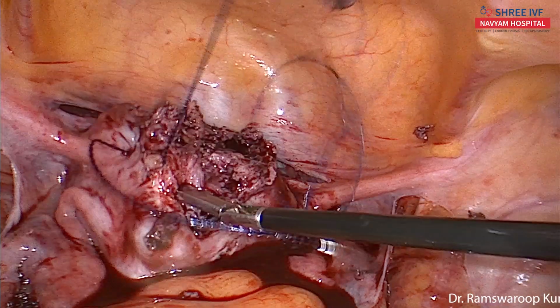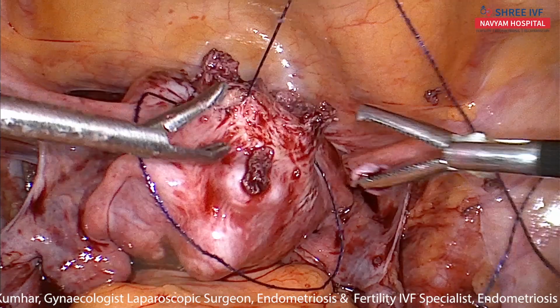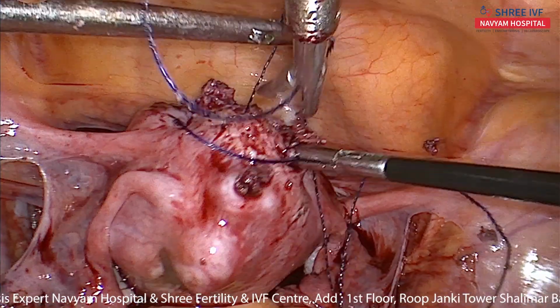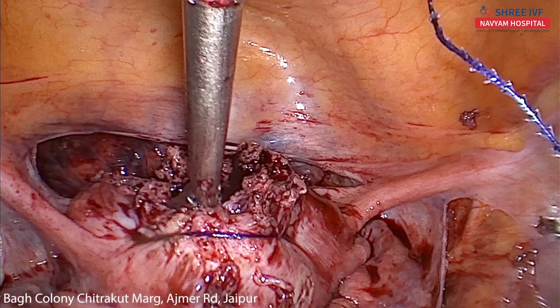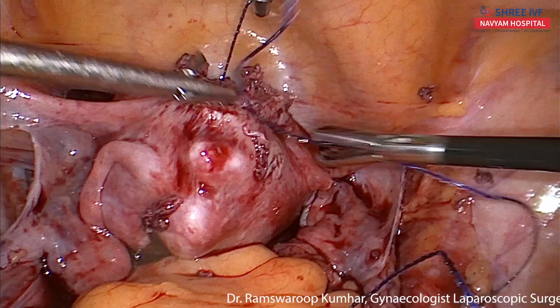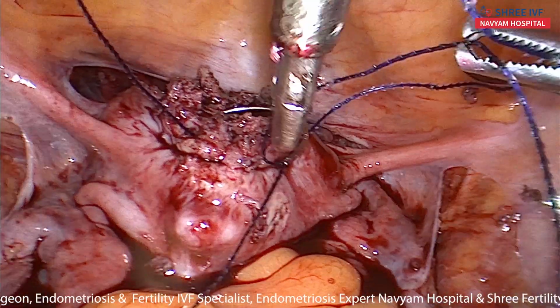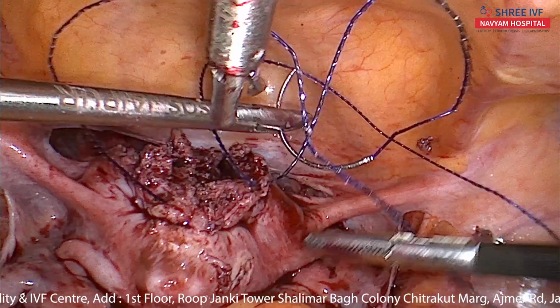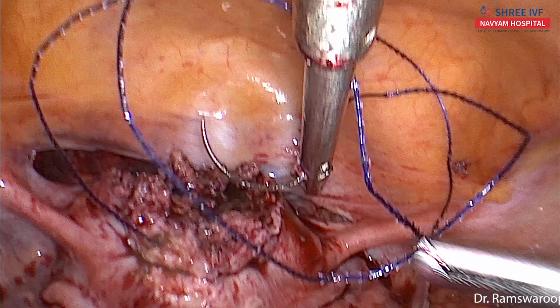The big suture has this problem. Leave it. No problem. And we will tighten it well. Pull the suture back.